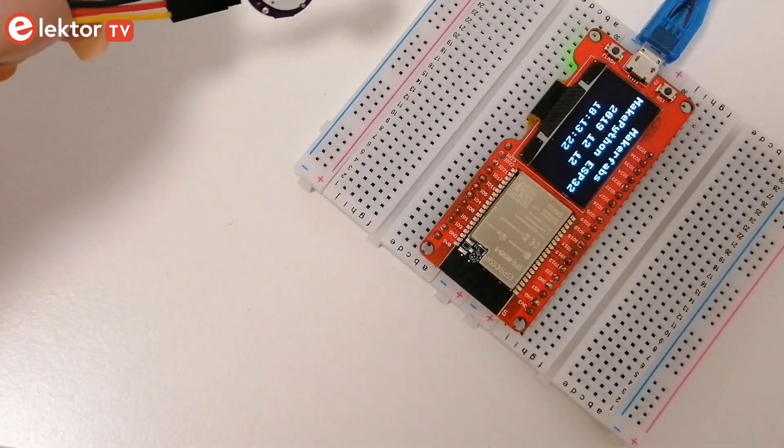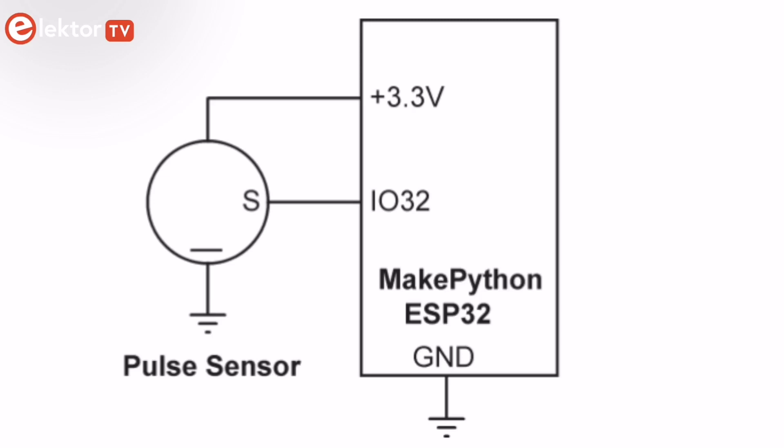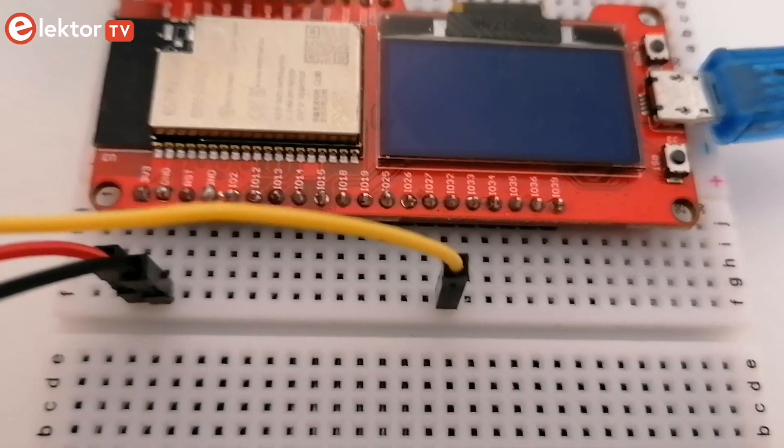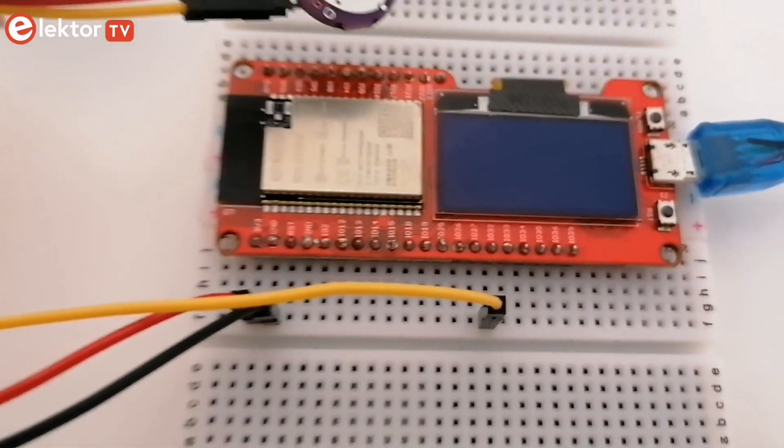Now let's take a look at the circuit diagram. The output pin S of the sensor is connected to analog input 32 of the dev board. Ground and VCC are connected to ground and 3.3 volt pins respectively. The circuit is very easy to implement.